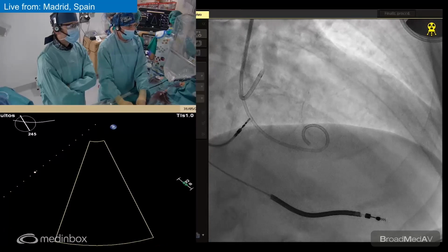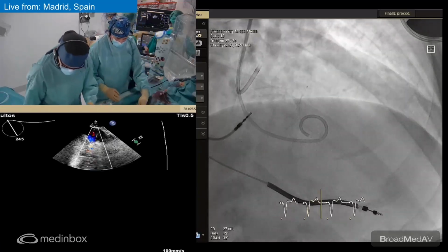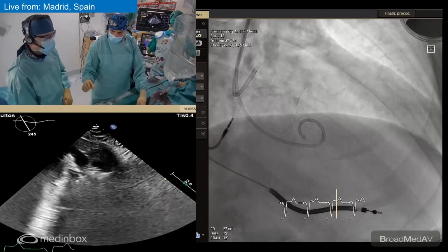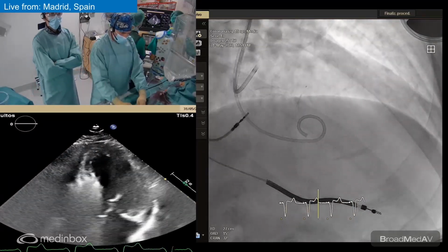It's a very small septal, but sometimes the smallest are the good ones. There is no collateral there. The balloon is nice. So the alcohol is this one, and the gradient has come down. Yeah, we are going with 1cc very slowly.